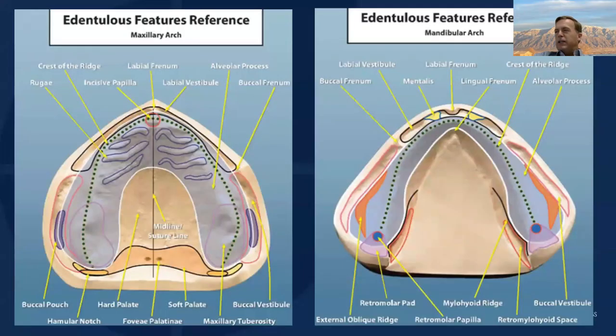One of the things I wanted to show with this picture real quick is that, as you guys know, border anatomy and having a very large impression becomes important with removables. You need to make sure that you capture the depth of the vestibules, the full palate past the vibrating line, the hamular notches, retromolar pads, and especially the external oblique ridge, so that we can get a nice, stable denture.